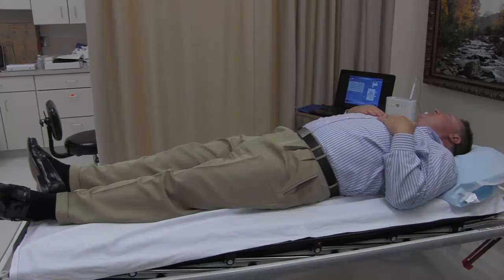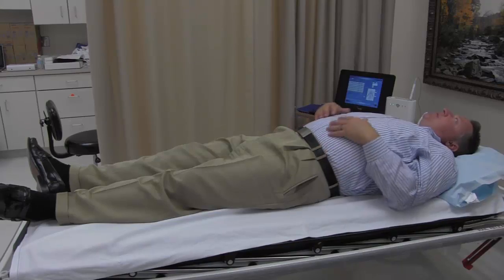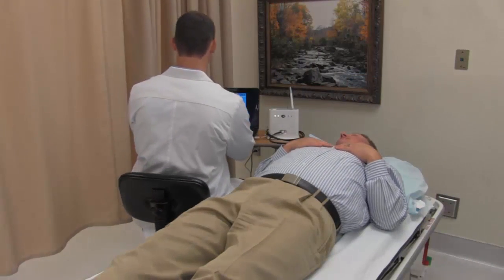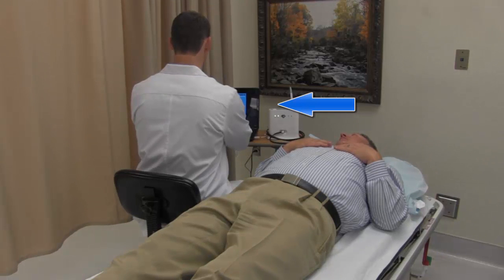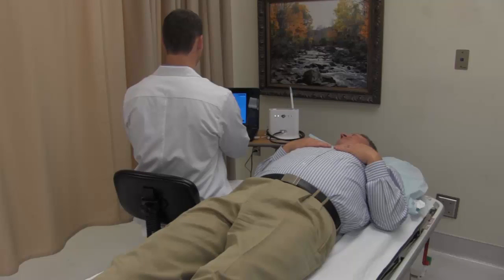It is important when conducting a pulse wave velocity assessment to arrange the room so that the computer screen can be easily viewed by the operator during data capture. In most cases, this is achieved when the computer is placed next to the head of the bed or exam table, the same end where the patient's head will rest.